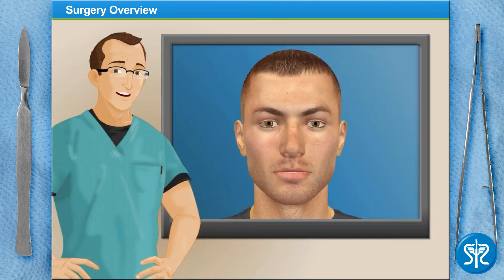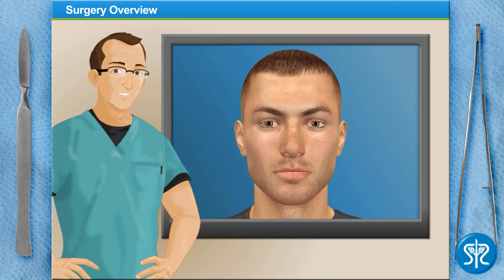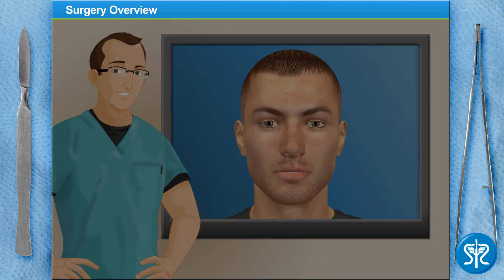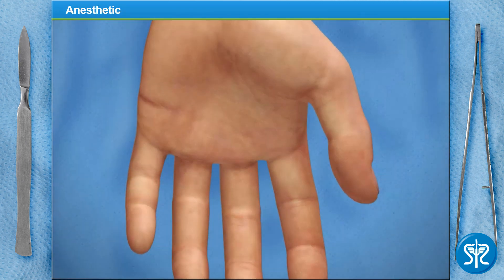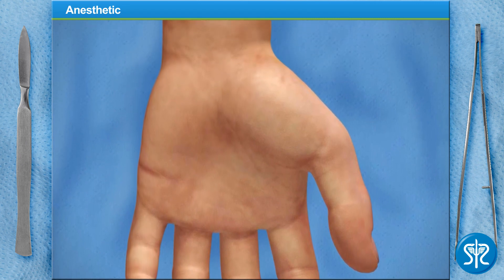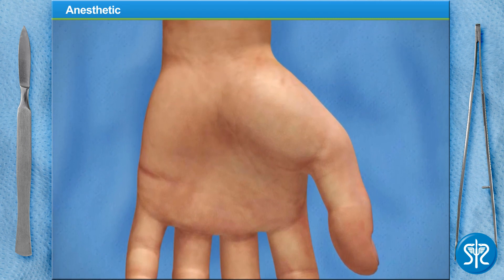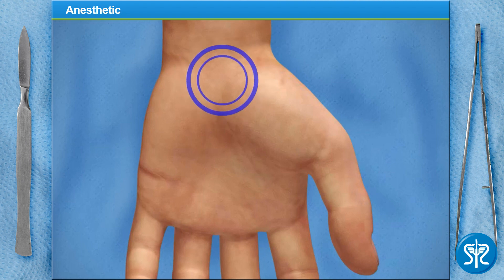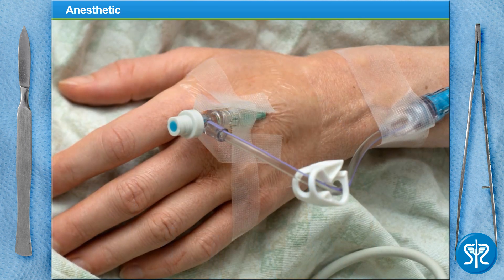Today we'll be operating on a patient who has been diagnosed with carpal tunnel syndrome after experiencing numbness and weakness in the palm of his hand and thumb. Now let's put on our gloves and get started. The limited open carpal tunnel release surgery is performed using a local anesthetic that numbs the carpal tunnel area of the hand and wrist. If a patient is nervous or uncomfortable, I'll sometimes use a sedative as well.